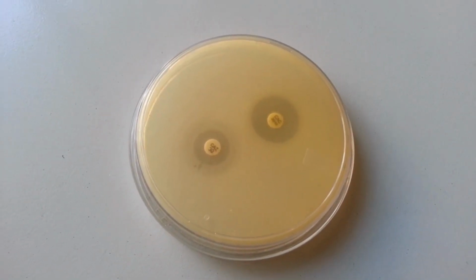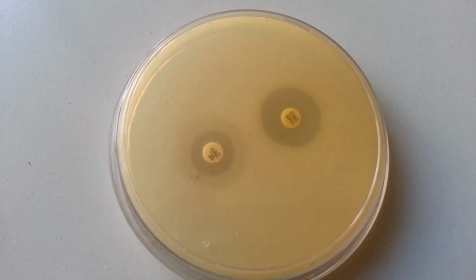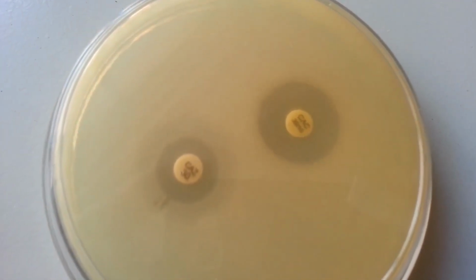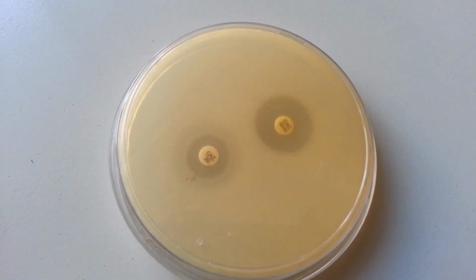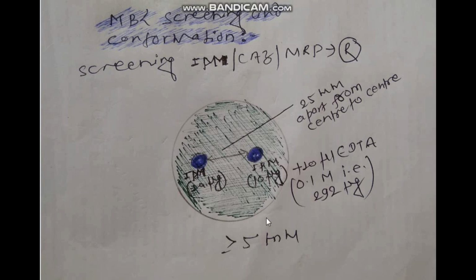Here we can see, this is the ESBL producer. Now about Metallo beta-lactamase screening and confirmation.